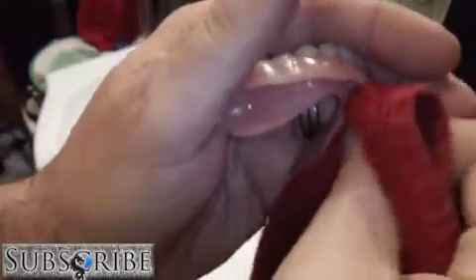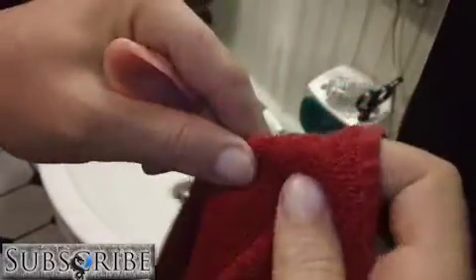So I'll take my folded up washcloth, pull my finger out, and just run it real gentle here. You're not polishing it or anything. You just want to get that water absorbed. And just go like that. You'll actually notice that this little ridge becomes moist and wet pretty quick. So just move it on to another spot. Do it again.